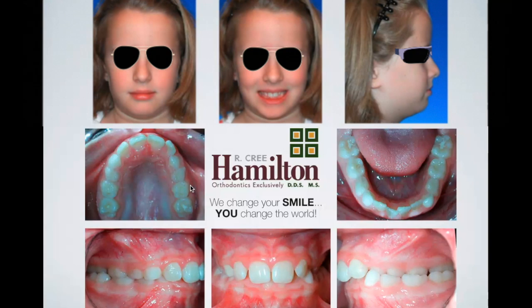Right, that means that once we correct the crossbite, they're going to shift back, and the midline will be closer to on. Now, chances are, I think this patient is over like 9 years old. Chances are that whole midline shift is not a slide. There's probably a component of this shift that is the actual mandible growing asymmetrically to the left side. More likely than not. You won't know that until you check for a shift or until you treat them, but we'll see what things look like after we treat this patient.